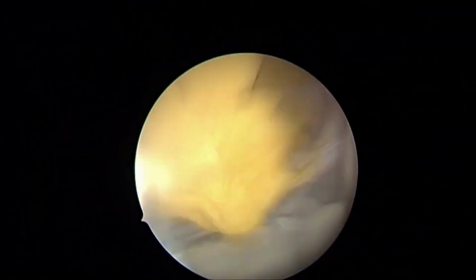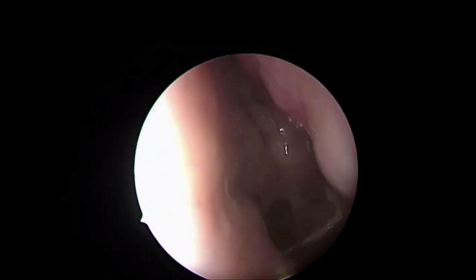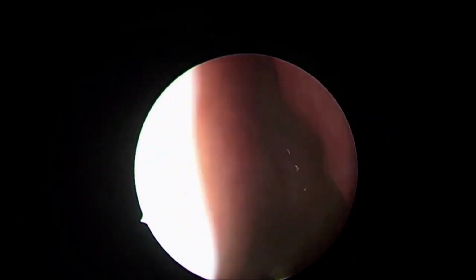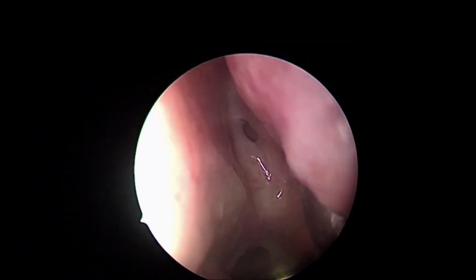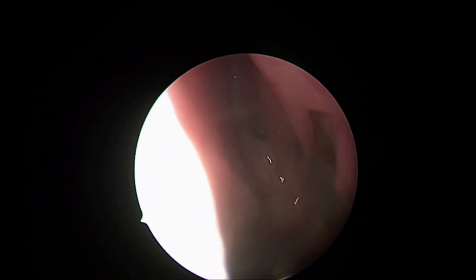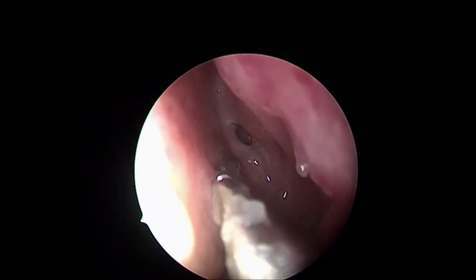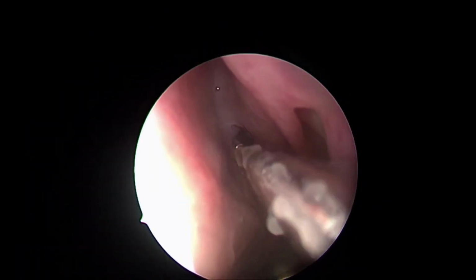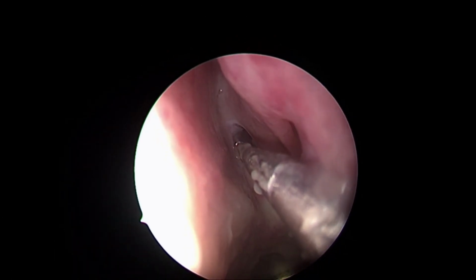Now, going behind, if I medialize this turbinate a little bit to show you something, there is another turbinate. See this? That is the superior turbinate. Medial to the superior turbinate, this is the posterior part of the nasal septum, is an opening known as the sphenoid sinus ostium, right in the midline.